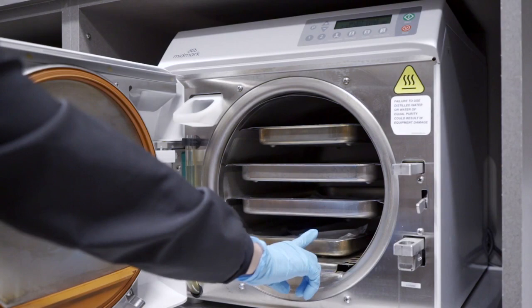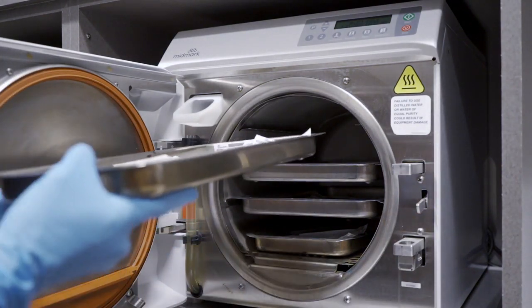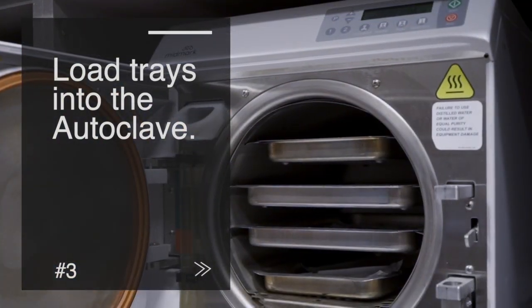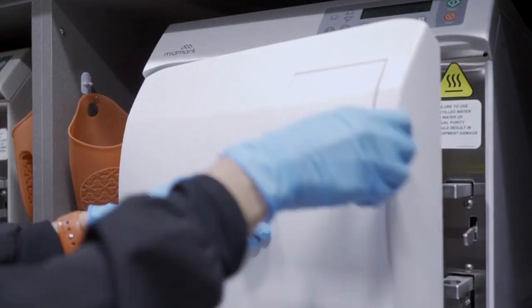Trays can be removed depending on the size of the instruments you need to process. Load the trays in, then close the door. Push it in slightly so that it clicks.